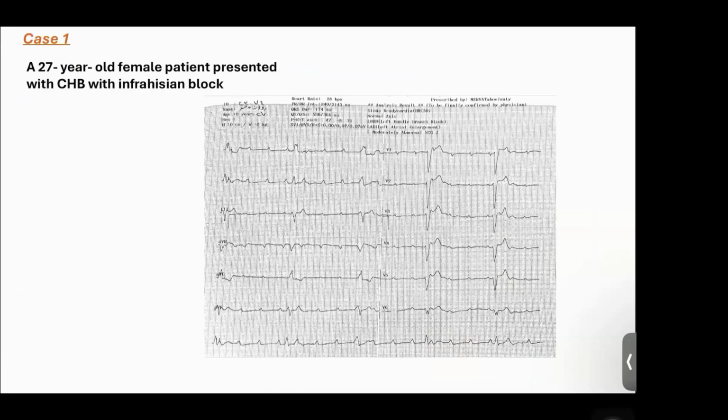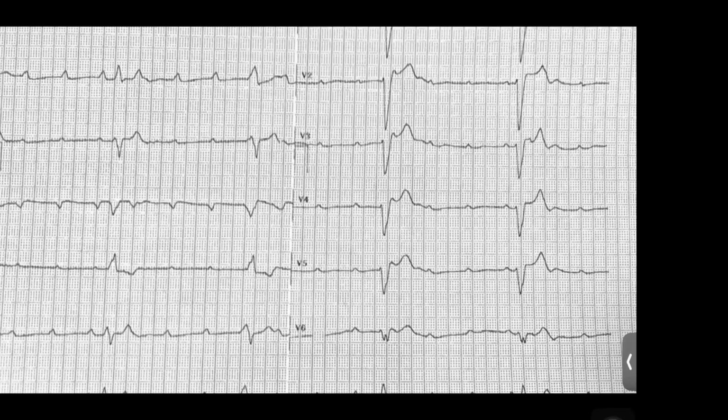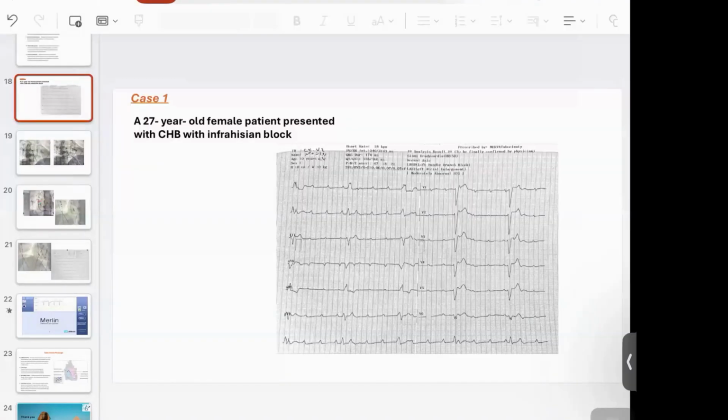Okay, I will present one case, a real case. A 27-year-old female patient presents with complete heart block and with infra-Hisian block. This is the ECG for her.